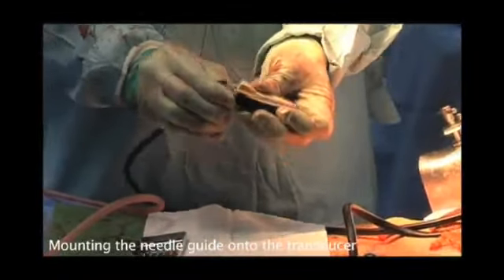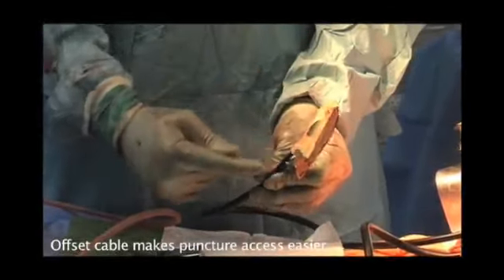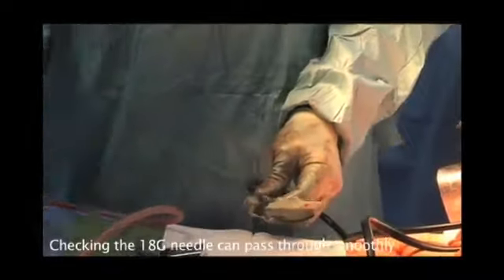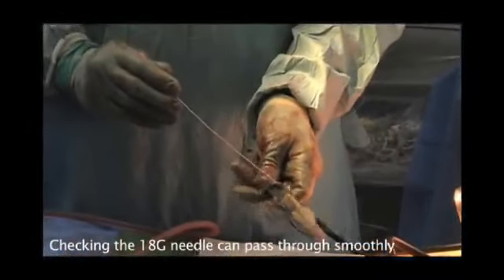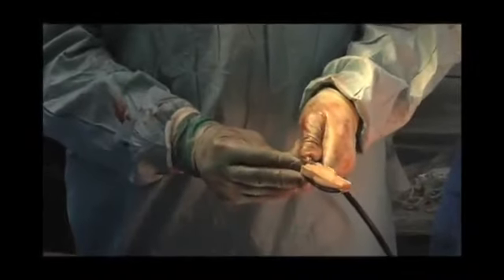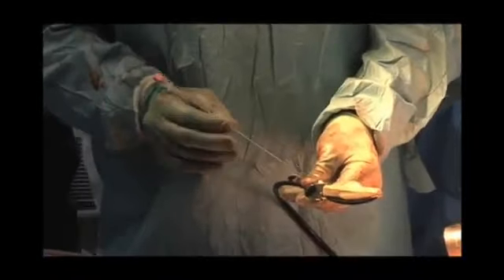Placing the bracket in position and then placing the whole unit, we can see the advantage that the communication to the transducer has been done here, which is a very unique design allowing us to make the puncture in this direction. Then we need the puncture needle. We are going to perform the puncture with an 18 gauge normal spinal needle, and we can just see that we should be able to pass through here. Otherwise we will have to find another insertion for that needle diameter — each needle diameter has its own bracket. By placing this one here, we should be able to place the needle and keep it in the steering device.